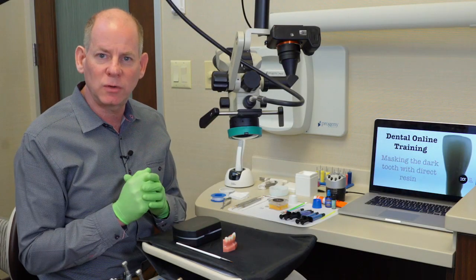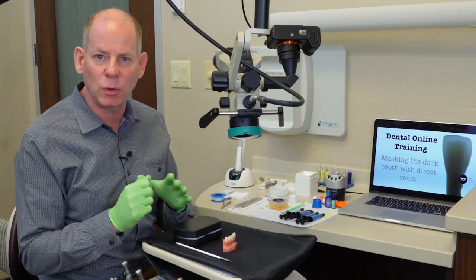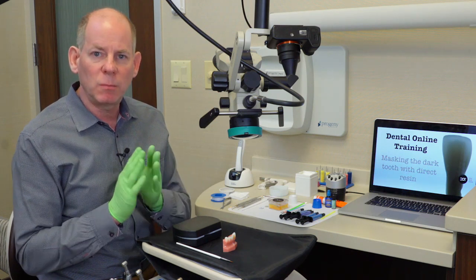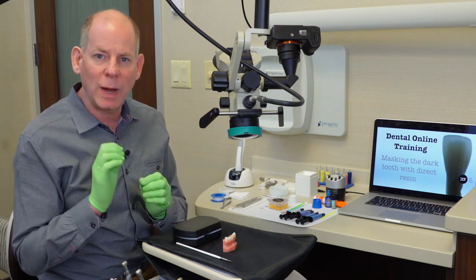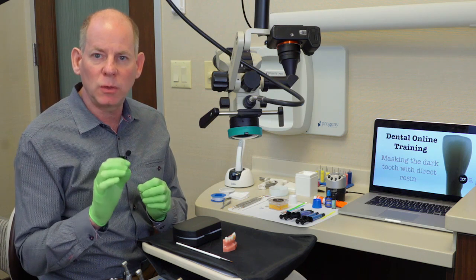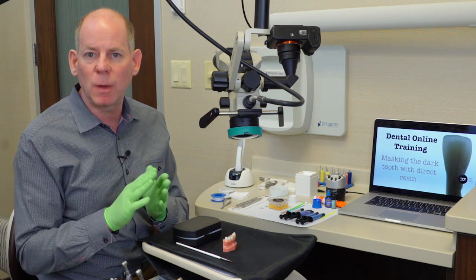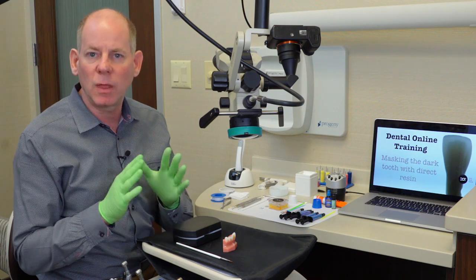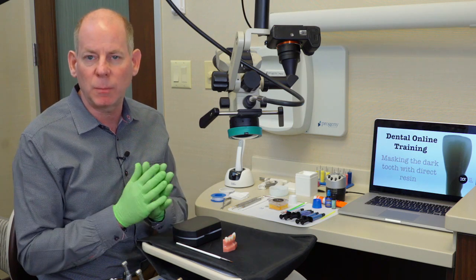Now that the tooth is prepared, we're ready to start placing our pink opaker. As I described in the lecture portion, the purpose of the pink opaker is to raise the value or brighten the tooth at what we call the sub-opaque layer, meaning this is going to be the first layer that we'll be using as we start building up our composites.